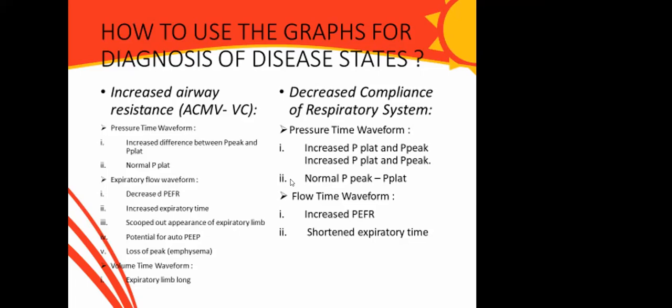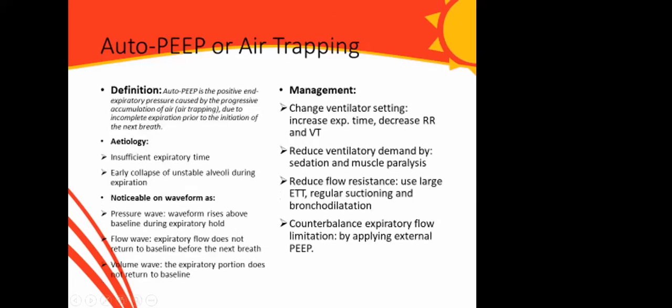So the ventilator waveform is interesting if we can interact more with it, especially in our ICU setting. Even during theater sessions, anesthetic machines that have ventilatory modes will show a ventilator waveform. Just interact with it, and the more you interact with it, the better you appreciate it. Any questions on waveforms before we go to auto-PEEP?